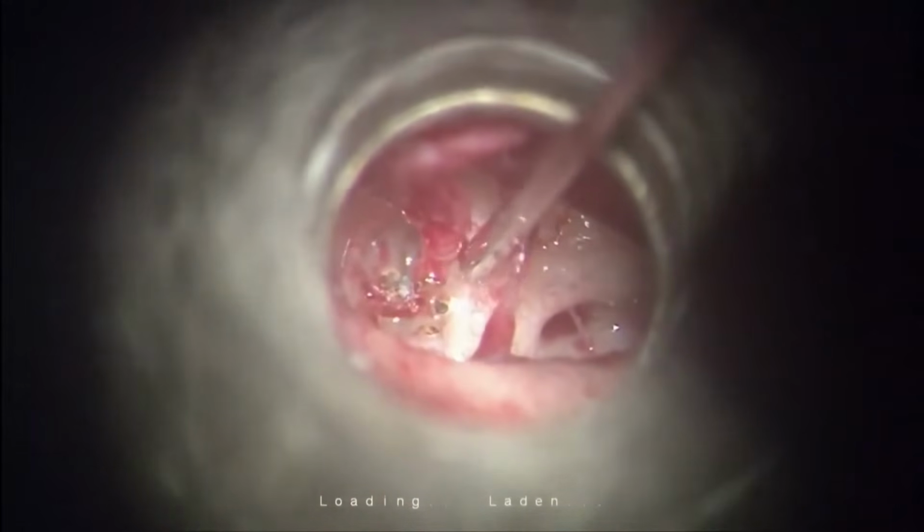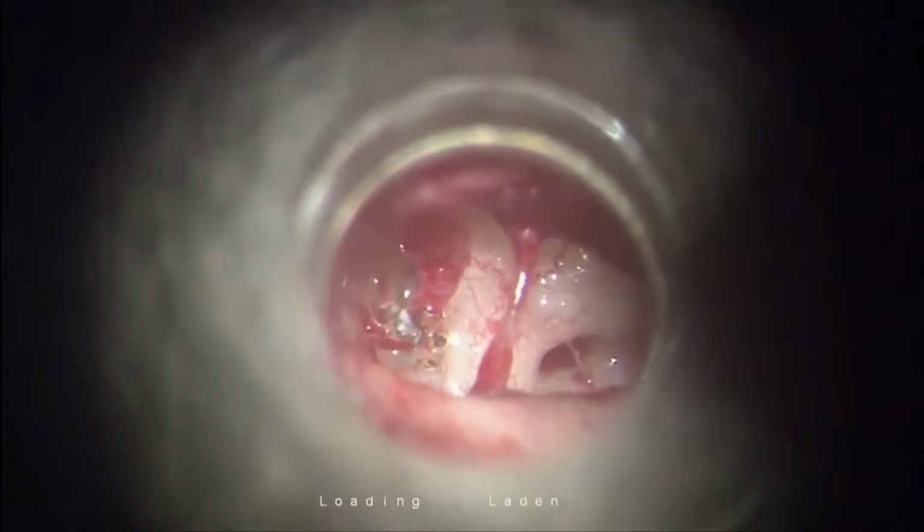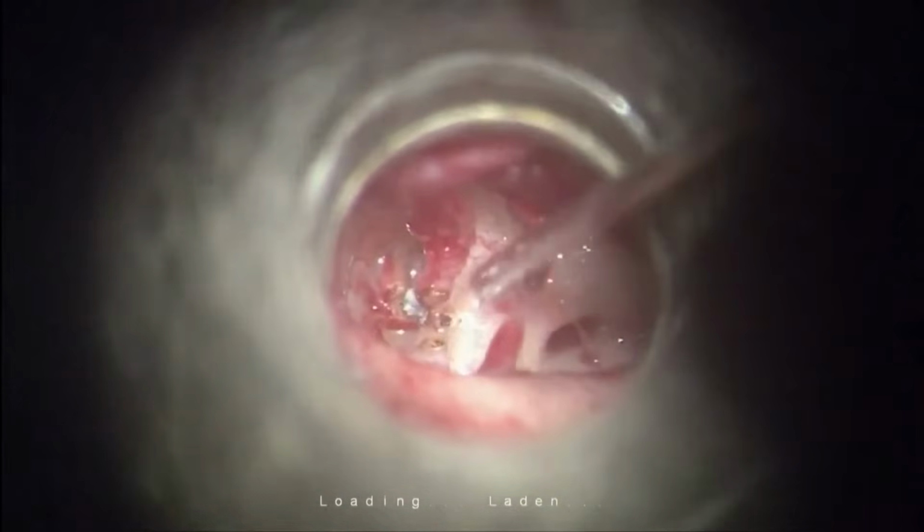Now what I'm doing is I'm using the laser to vaporize the posterior crust. Can you see this? Yes, sir.